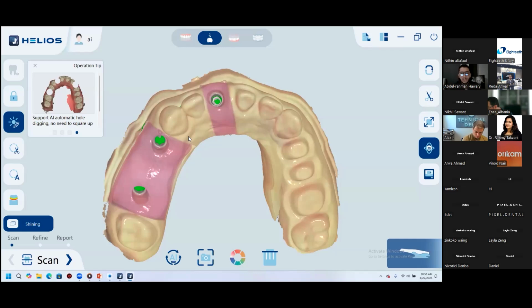But if you're just placing an upper arch that's completely edentulous and has no occlusal stoppers and no points of occlusion with the lower arch, then it will not be able, of course, to detect the bite. But like I told you, the scanner will be able to scan whatever you put inside the patient's mouth. It will not reject scanning.